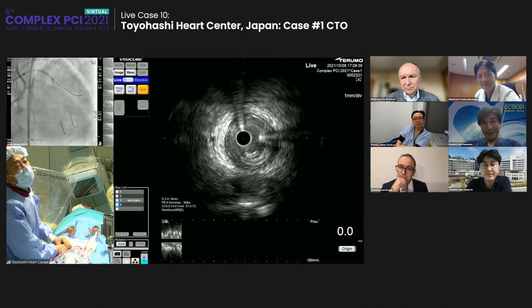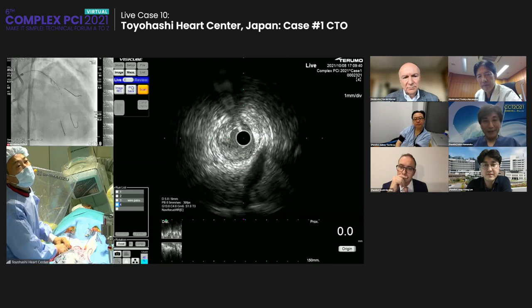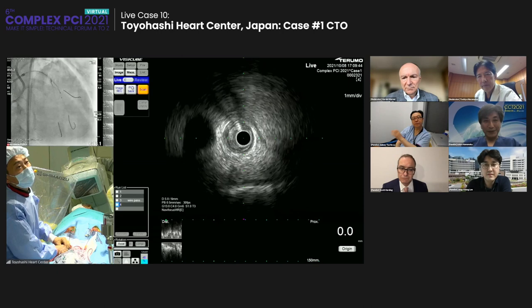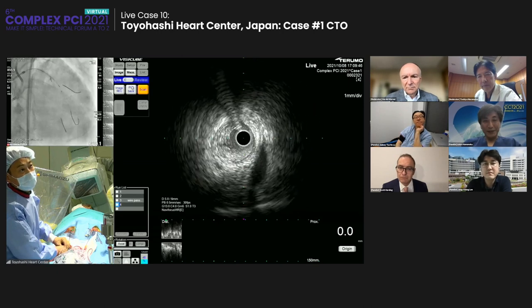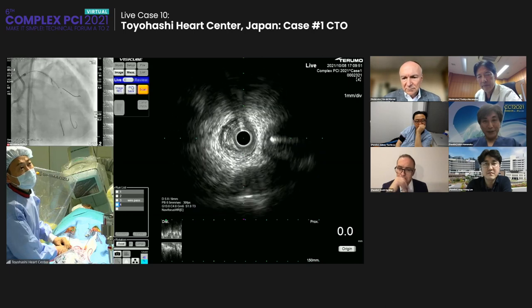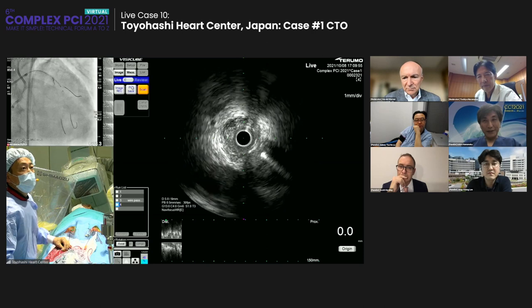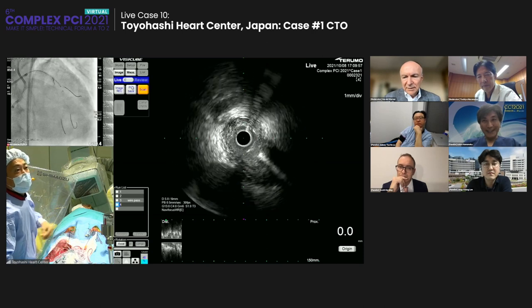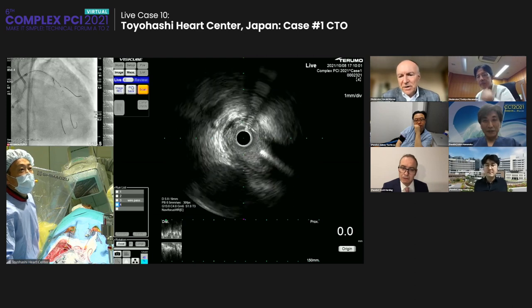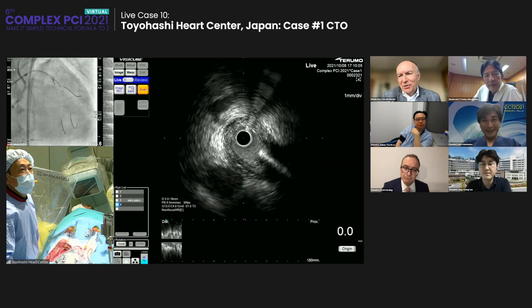I'm afraid that the distal side of the LAD stent is very complex, with double to triple stent layers from the previous PCI. So if we use the culotte stent, I wonder how many stent struts there will be. But if you expand it very well to the wall, then the stent struts will go away.